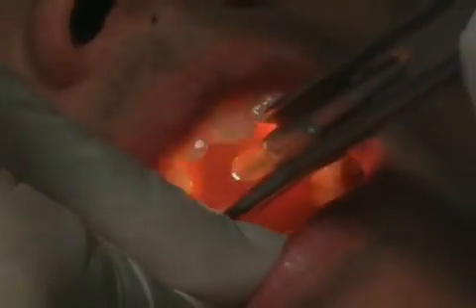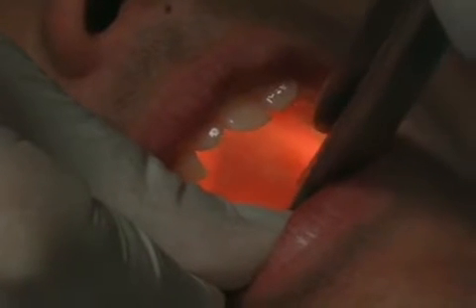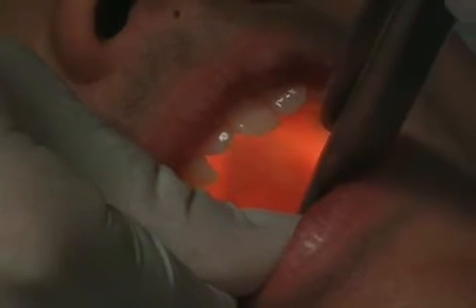The laryngoscope is inserted into the mouth and the glottic opening is visualized, which may require the use of suction to clear secretions from the posterior pharynx. First, you see the epiglottis and the introduction of the straight blade. You see it picking up the epiglottis and the vocal cords coming into view.